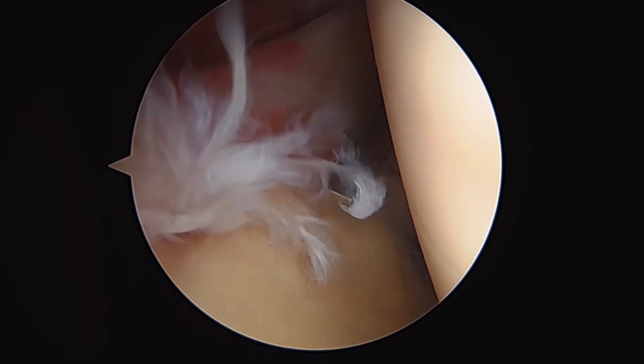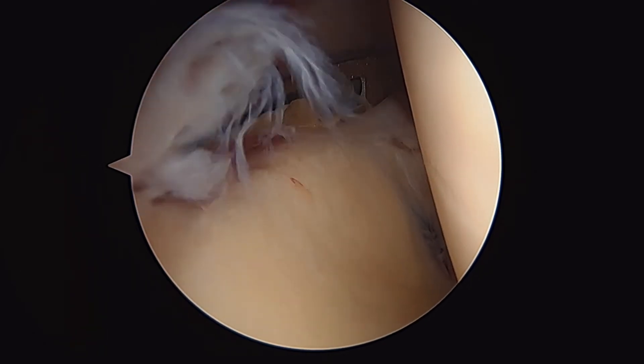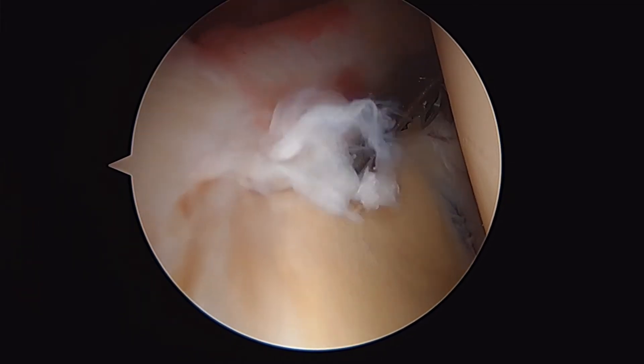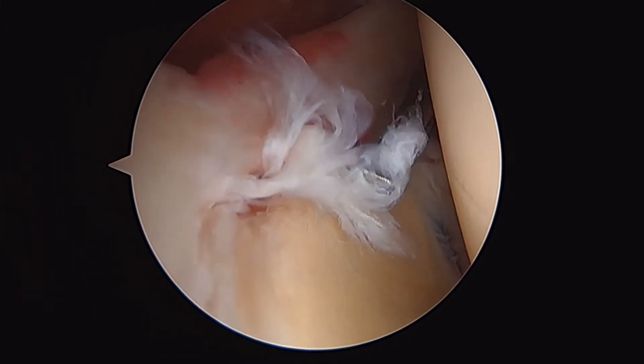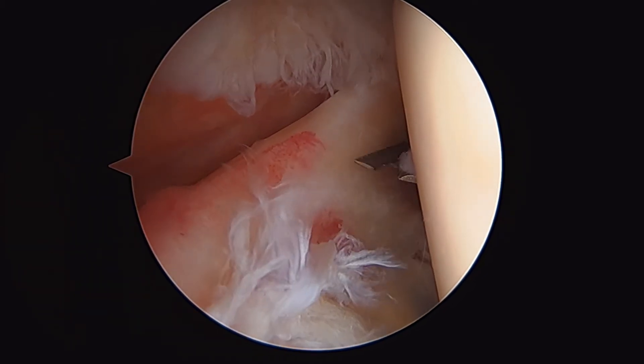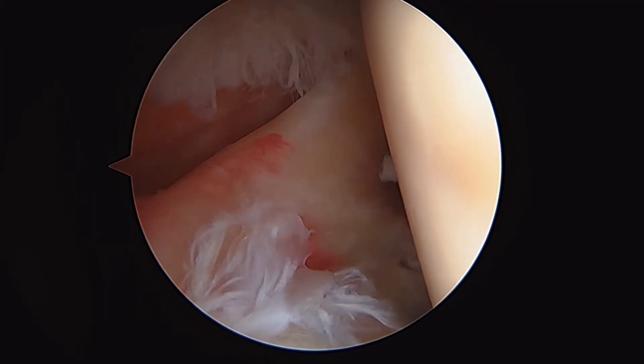This is what a type 2 SLAP tear looks like. You can see this labrum should be secured to the superior glenoid rim here, and you can see all the frayed tissue. So in this patient, we're going to perform a biceps tenodesis.